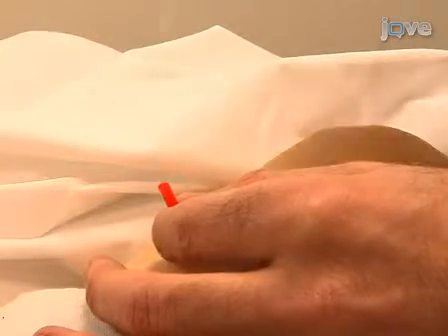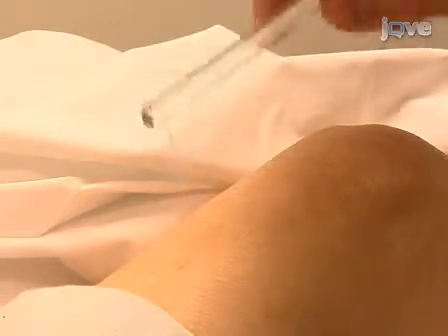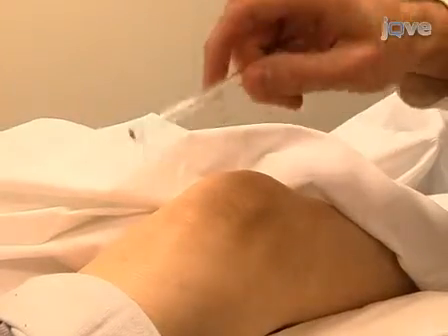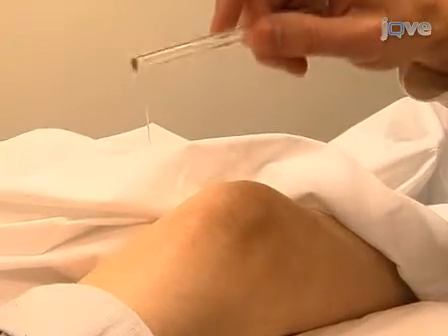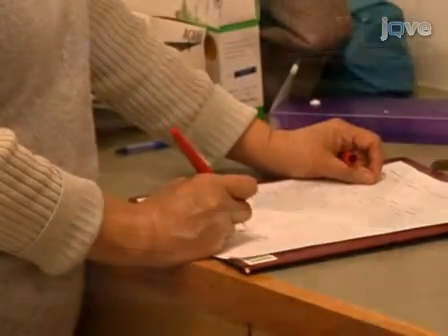For sensory control or sham acupuncture, we deliver superficial tactile stimulation to the acupoint with a size 5.88 von Frey monofilament and a matched paradigm. This is done before real acupuncture stimulation to the acupoint. It can be done by free tapping of the filament or by inserting filament through a guiding tube used for acupuncture needles. Upon completion of acupuncture stimulation, record the force with which the needle resists manipulation.